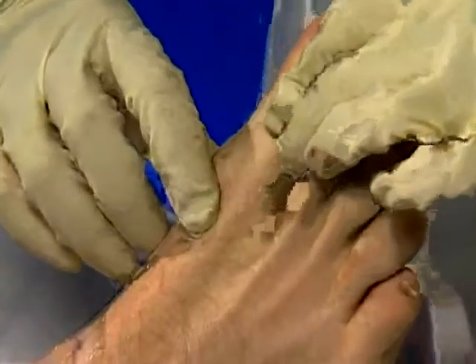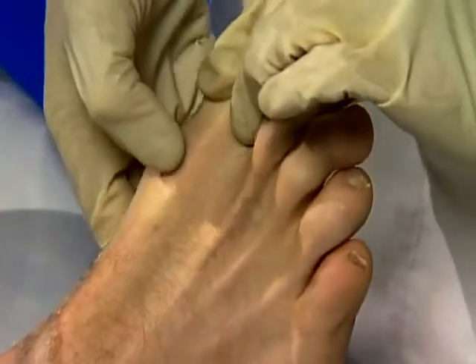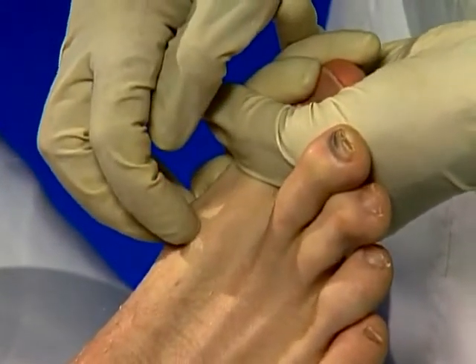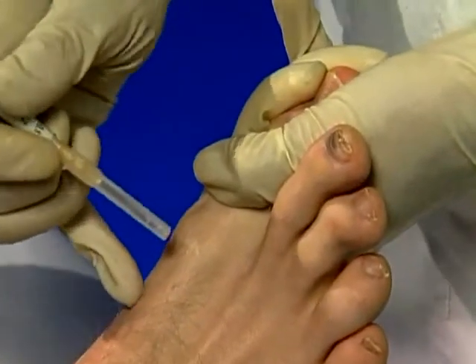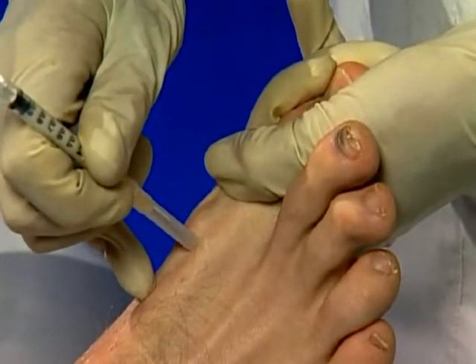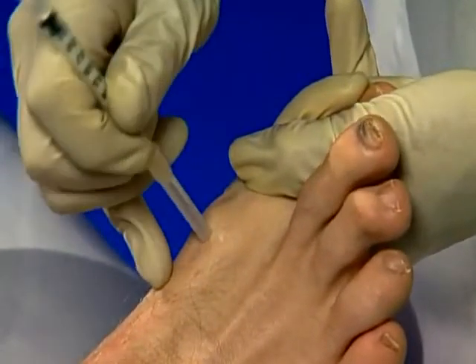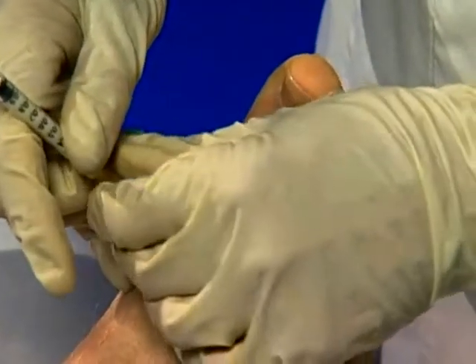Find the joint line by extending and flexing the toe. Apply distraction and mark the entry point. Clean and firmly stretch skin and rapidly insert the needle perpendicularly into the joint space. If it does not enter straight away, flex the toe a little more and move the needle about until it is within the space. Aspirate and inject as a bolus.